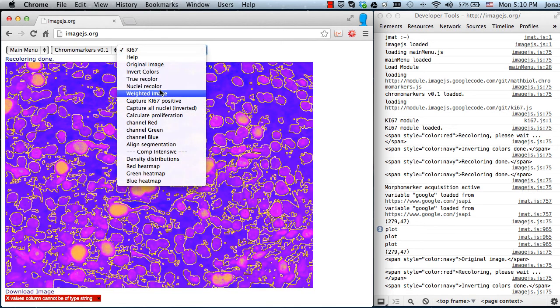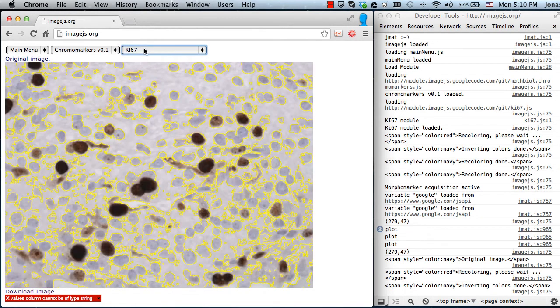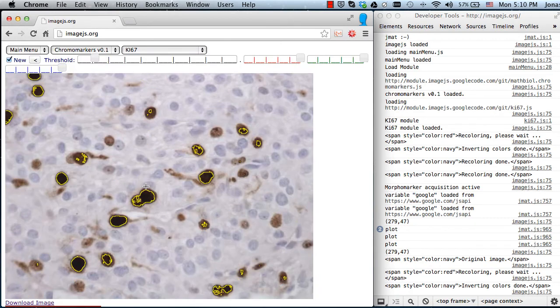And whenever you're okay with it, let's capture all nuclei inverted, meaning that we are capturing everything that is not a nuclei. That's why we aimed at the background. Now it's captured. Let's now move back to the original image and now do the segmentation only for the labeled nuclei. Maybe a little bit more permissive. Or I'm guessing here. I'm not sure exactly if this is what you find acceptable. So let's say you find this okay.